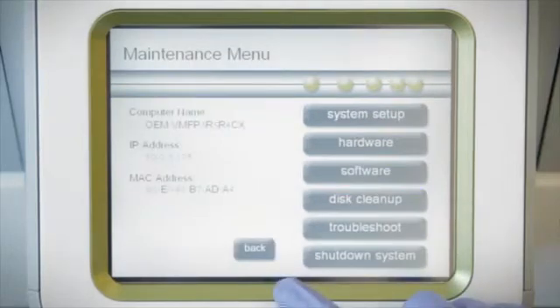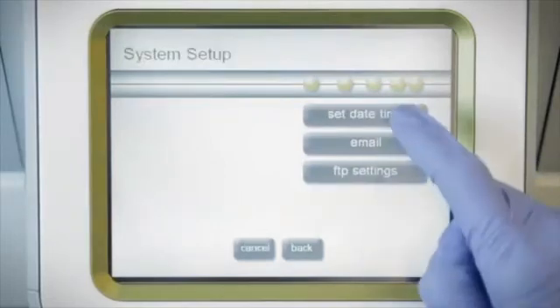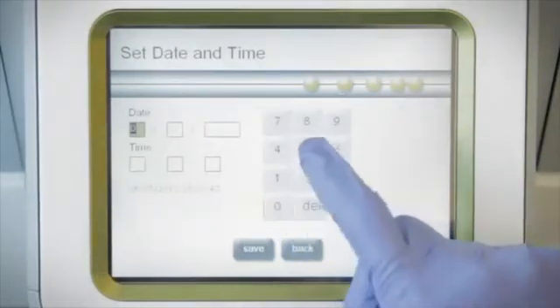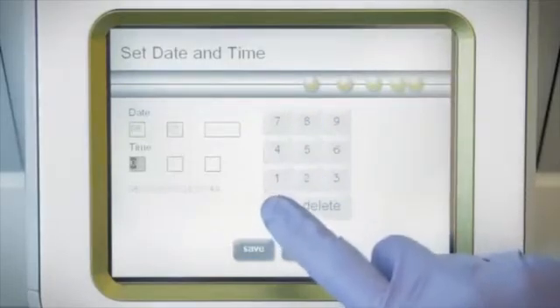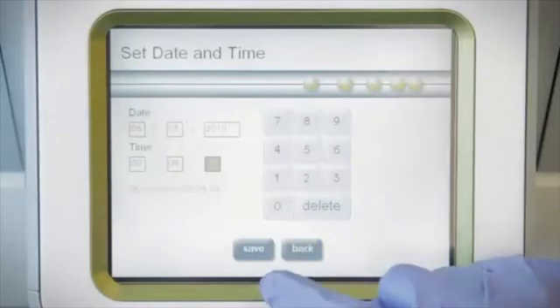The date and time can be set by pushing the system setup menu, followed by the set date and time menu. Using the touchpad, enter the date and time. Note that the time is entered in 24-hour format. Push the save button when finished.